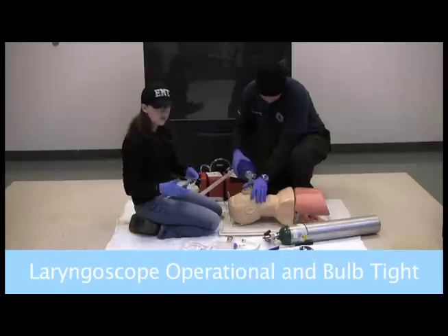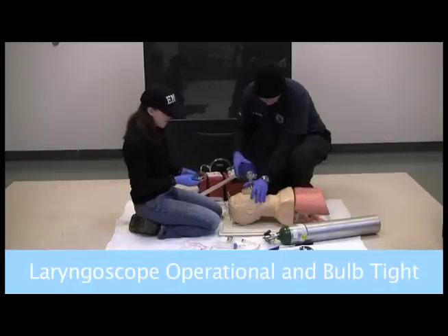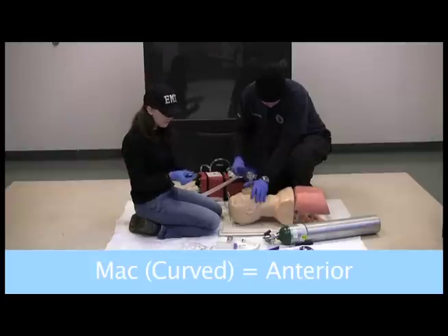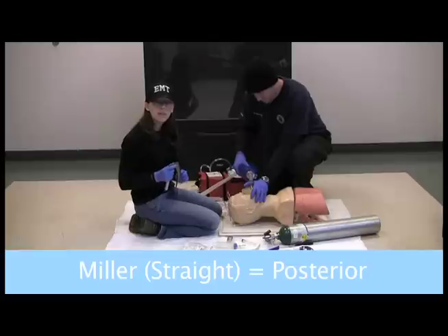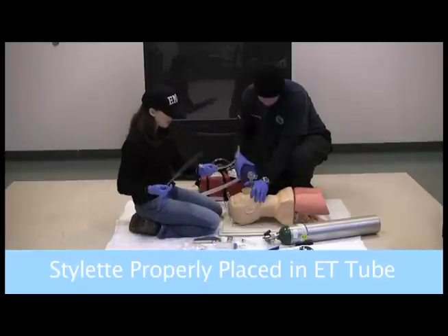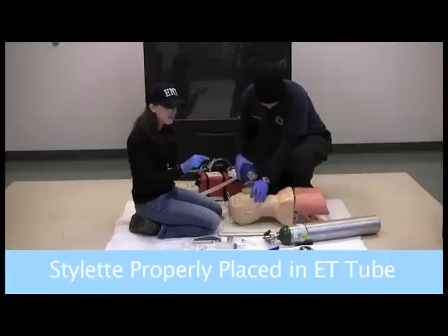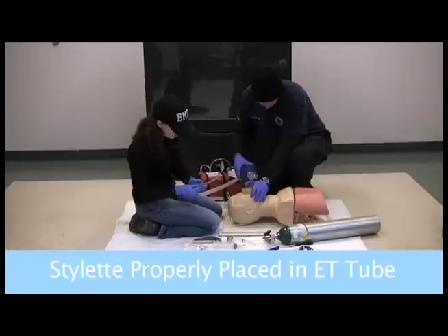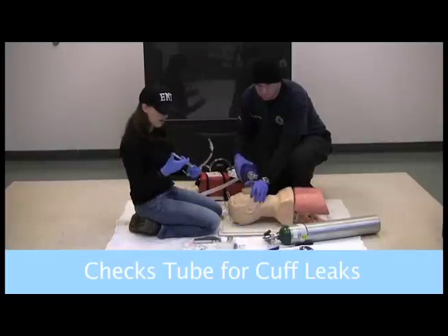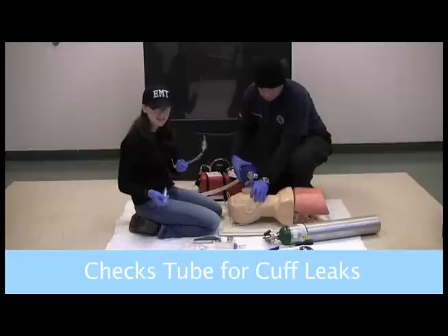I'm looking at my laryngoscope, making sure that the batteries are good, making sure that the light is tight and bright — it's not going to come off. I like the MAC blade; it's the curved blade. This blade is placed anterior to the epiglottis. If you have the Miller blade, which is the straight blade, you place that posterior to the epiglottis. I have my tube. I want to put in the stylet — I've bent the end so that the tip doesn't extend beyond the tube. I also want to check the bulb by inflating it, making sure I'm not seeing it leaking anywhere, that it stays inflated. It looks good.